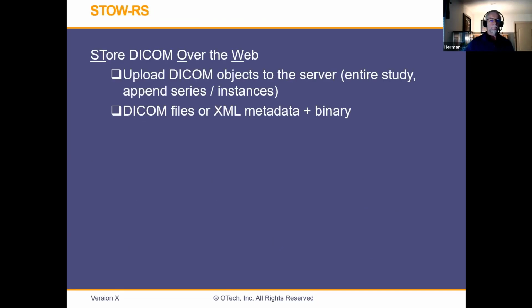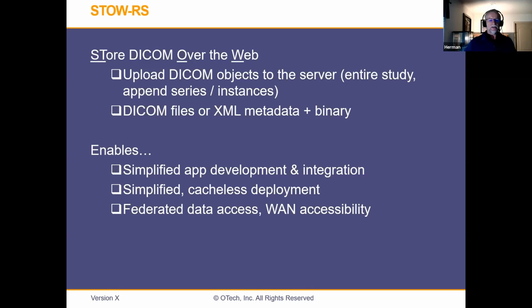So STOW is the first command we're going to talk about. Store DICOM over the web. So we have an image on my phone and I want to put it in the PACS, right? DICOM files or XML data and binary, right? Simplifies the application development, cache-less development, deployment, federated data access, ubiquitous accessibility, right?